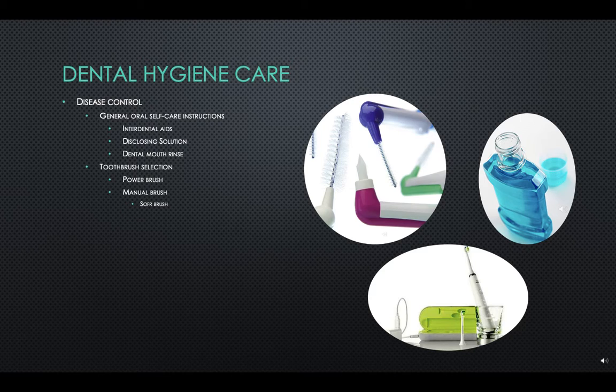Toothbrushing procedure. Circular brushing. A circular method is needed by most patients for cleaning the appliances and maintaining the gingiva. Power brushes are adapted for circular as well as any other brushing procedures. Adapt for appliance. Special adaptation is required for facial surfaces.